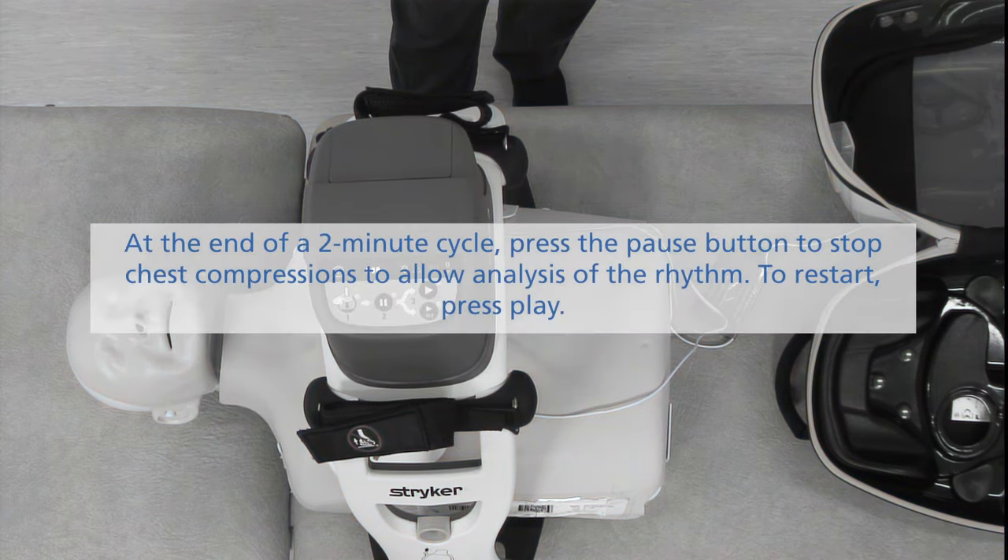At the end of a 2-minute cycle, press the pause button to stop chest compressions and allow analysis of the rhythm. To restart, press play.